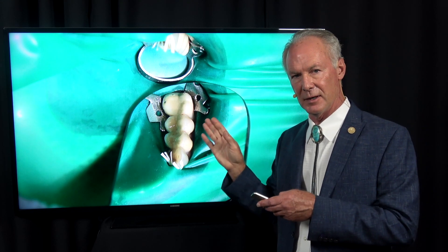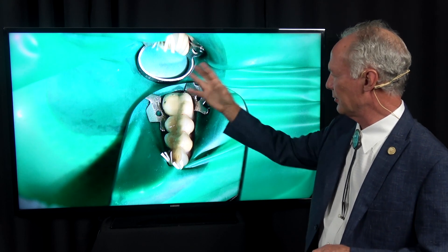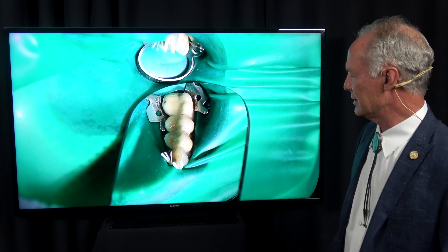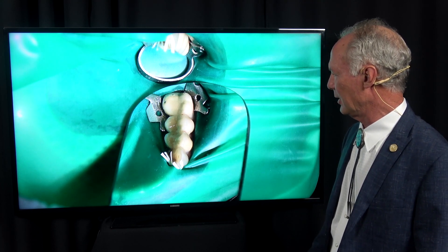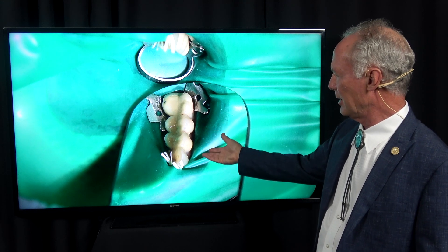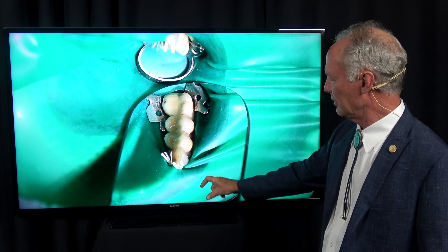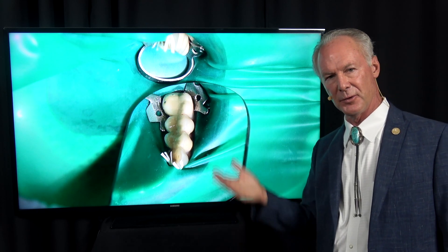Now some people say that's not as stable as individual holes — I go into that in the video. What does this accomplish? It keeps any of the pieces of the bridge from falling into the patient's mouth. It keeps 95% of the water out of the patient's mouth because the assistant is aspirating as you're working. It keeps the tongue and lips out of the way. I use this rubber dam method every day, even for extractions, because it's so easy — it takes about 30 seconds to place.